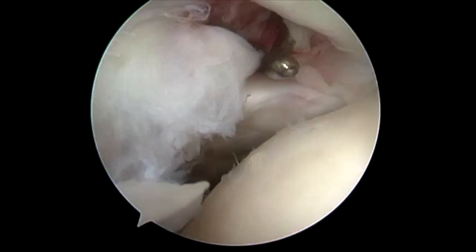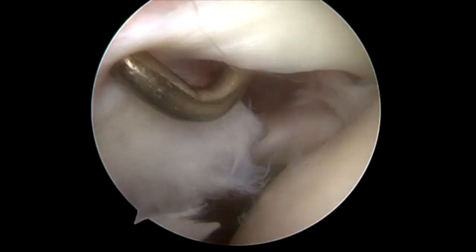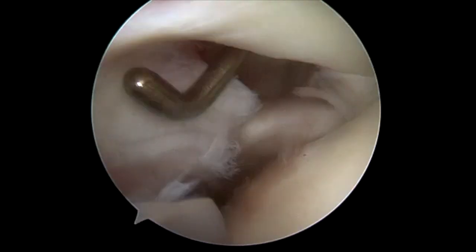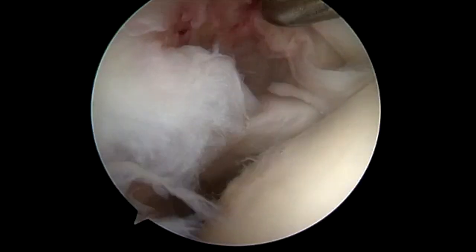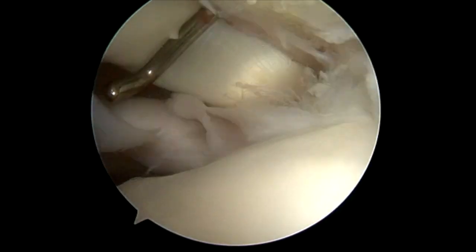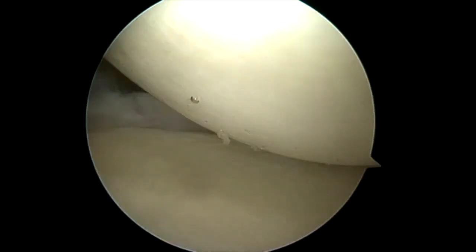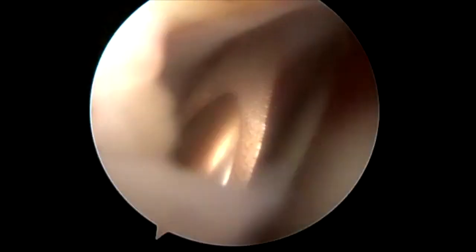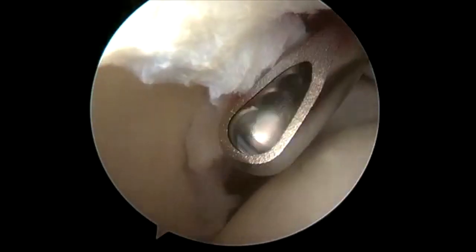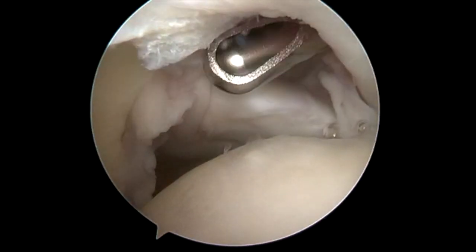Here we are, lateral position, right shoulder. This is a 47-year-old woman who had an injury about eight months ago — she took a fall and had a non-displaced greater tuberosity fracture. That healed in a sling with therapy, but she persisted with shoulder pain. An MRI scan showed a very unstable SLAP lesion with frayed edges, and she also has a partial tear of her medial bicep sling that allows the bicep to partially subluxate in the groove. That's the most common indication for arthroscopic biceps tenodesis in my practice. A SLAP lesion in a 47-year-old, with or without a bicep sling tear, is a biceps tenodesis. I can get them moving and into therapy quicker, and ultimately they have less stiffness, better function, and better clinical results.